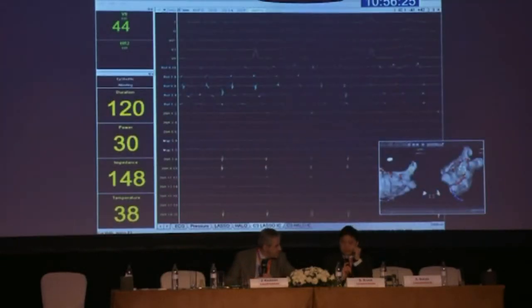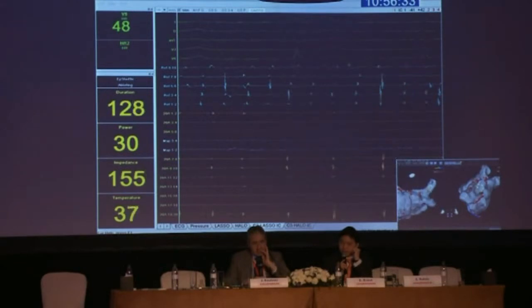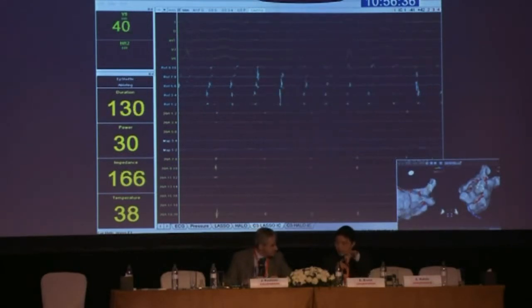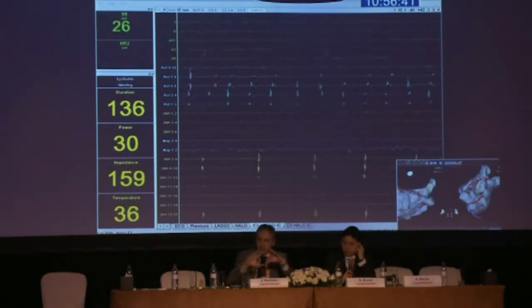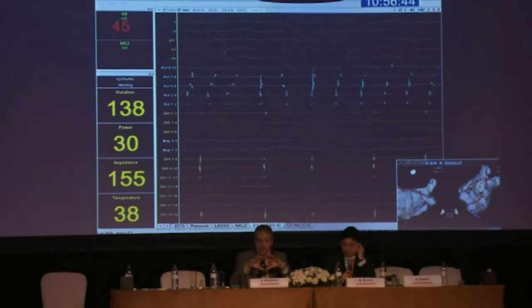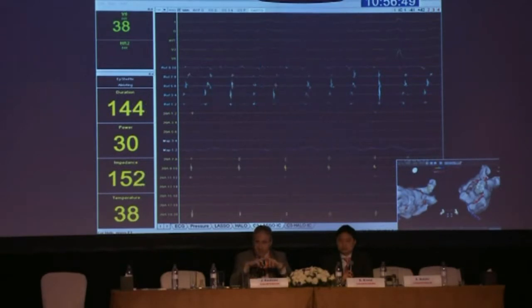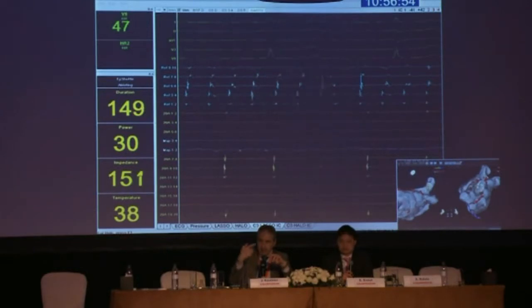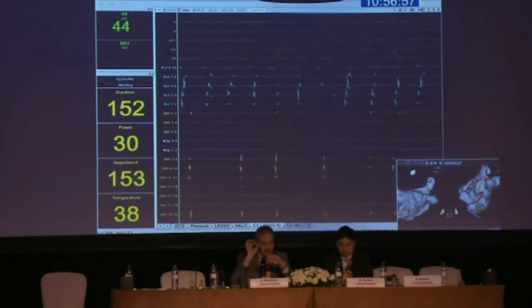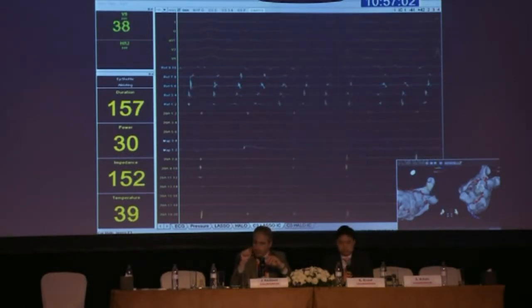I suggest that there's only one entry point into the vein. Yeah, there's only one entry point. Because obviously it can be just one tiny fascicle that feeds into the whole vein. So I think that's probably the interpretation. There is a tremendous variability from anatomical studies. I was part of one study where we analyzed post-mortem, and these fibers are crisscrossing. So although there is some sleeve around the whole circumference of the vein, the conduction could go preferentially only in one area. So even with few points, you can isolate the whole thing.